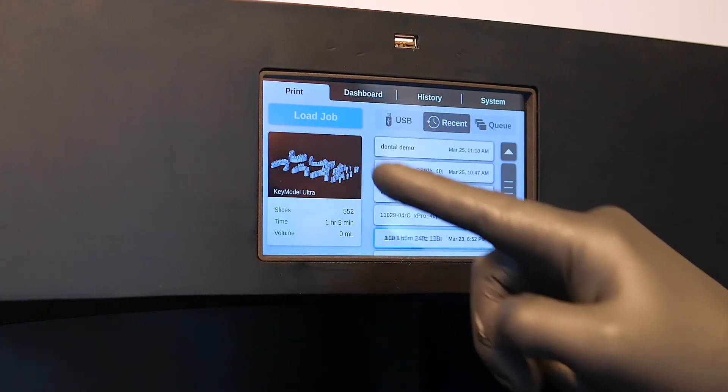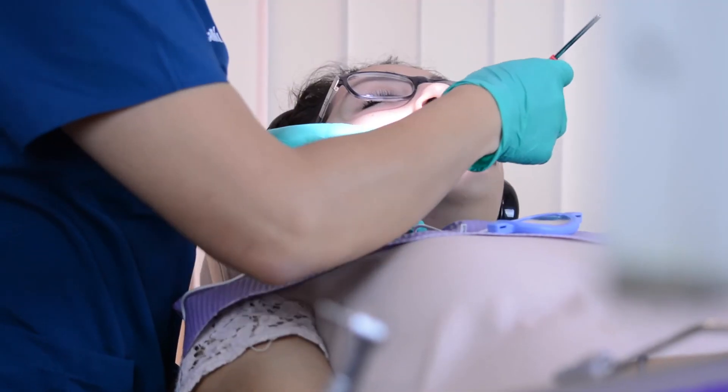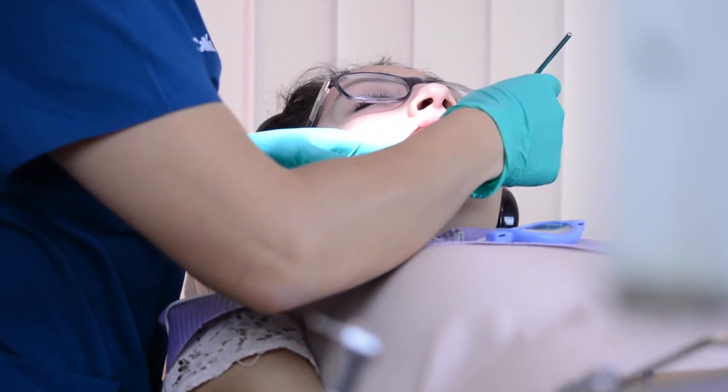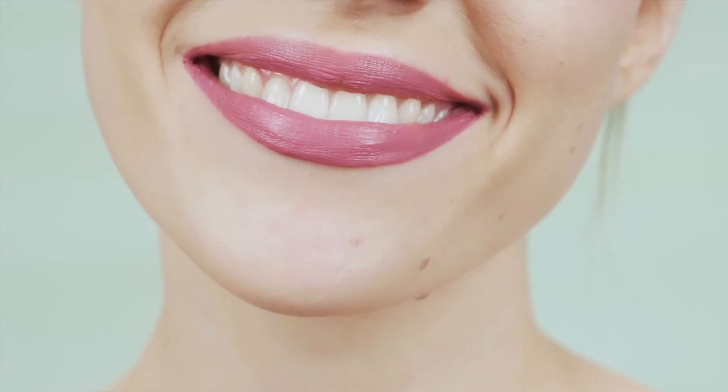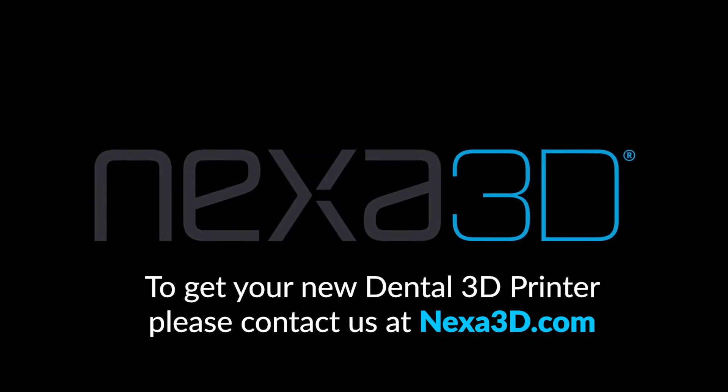Nexa 3D's dental partner ecosystem provides design and backup or incremental manufacturing services, allowing you to focus on keeping your customers smiling. NXT 200 by Nexa 3D — digital dentistry will never be the same again.